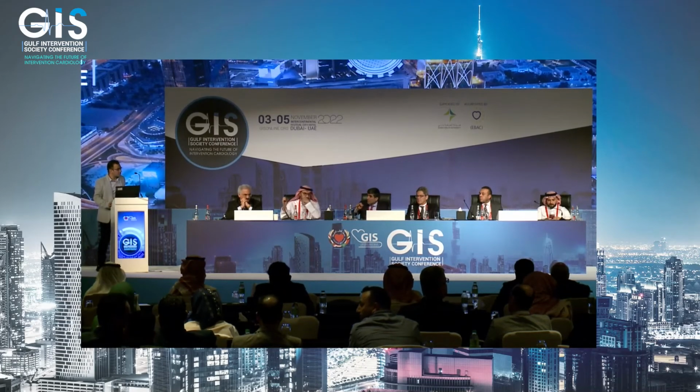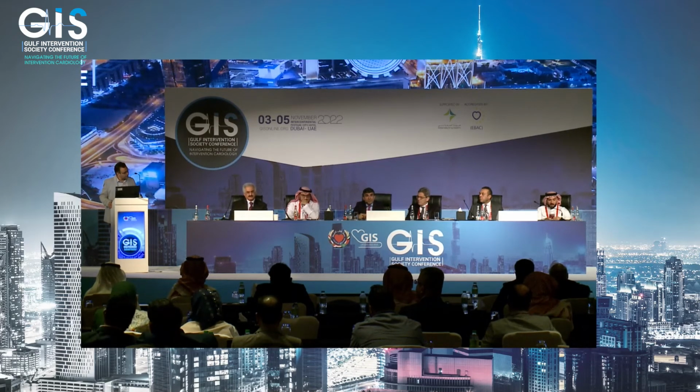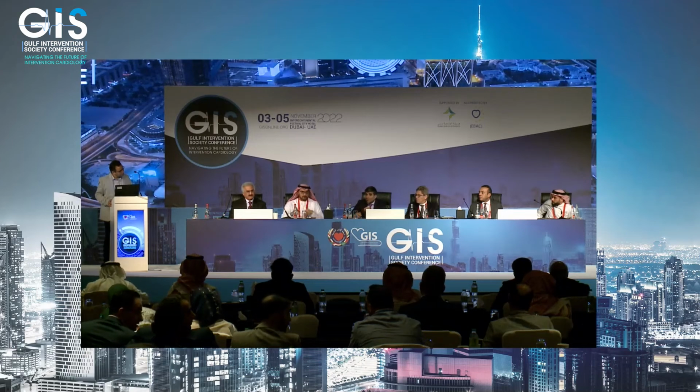Dr. Mohamed. Very good cases, and thank you for sharing these. You summarized how to deal with the lost stent quite well. One of the important things, every time you try to take the stent out, if it's not passing, is to make sure you inspect it. I have seen people who took the balloon out and thought the stent was still there, and it was completely lost in the coronary system. So it's important to check that. The steps you described and also the conclusion are quite important. Be prepared to deal with these cases as always, and a very good save.